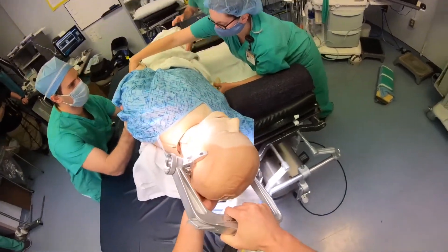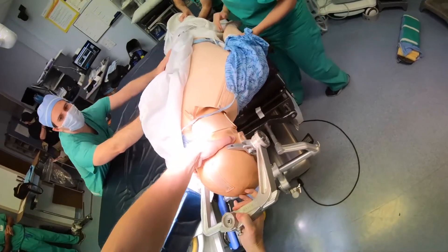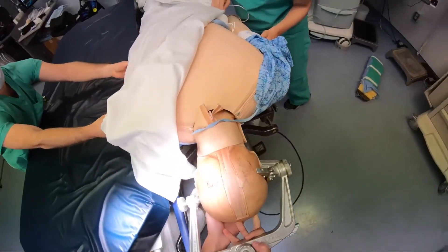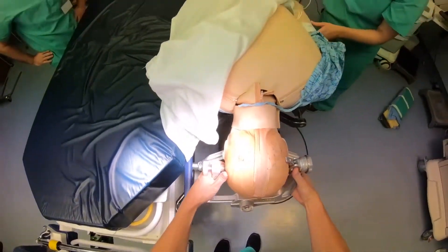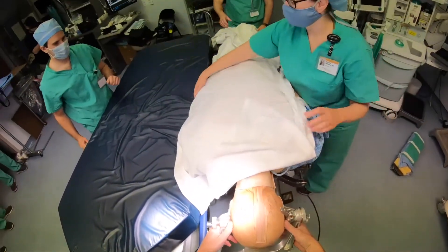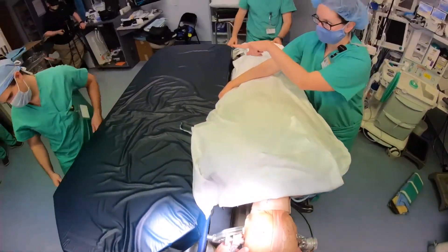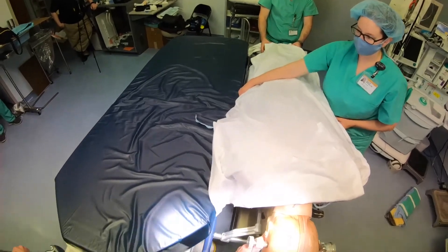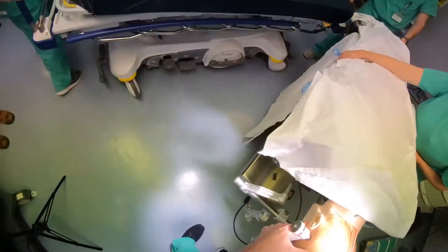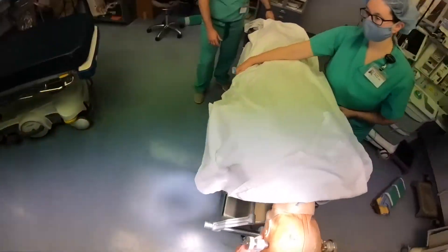You want to move slowly and in line with the body if you're on head. Now this is where it's helpful to make sure somebody has both arms and then somebody has to get the stretcher out of the way. While we're supporting the arms, we move the stretcher away, and then we'll often have the arms with several pieces of foam — go ahead and bring up the sheet to support the arms.